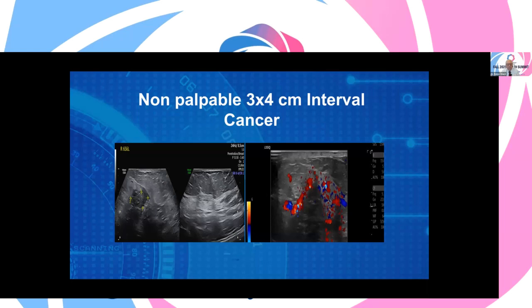We have ways of doing it simply. So there's thermal imaging, which could show this. There is blood flow imaging. We have other technologies, which I'll show in a few minutes. But let's go back to the top of all those red and blue dots.